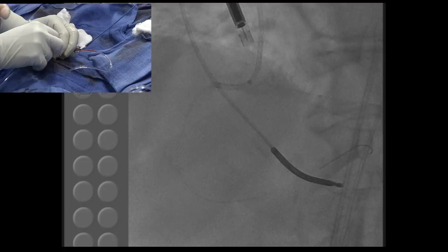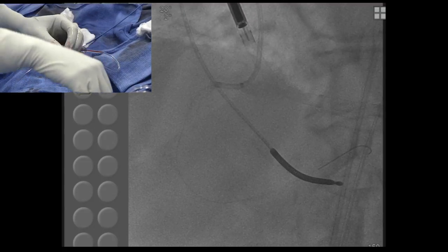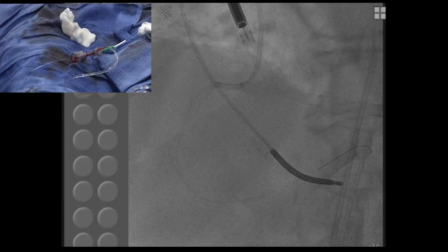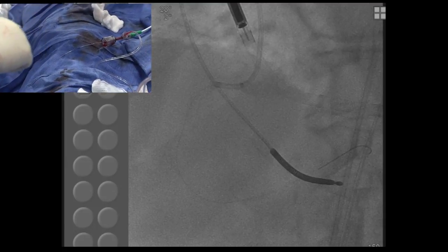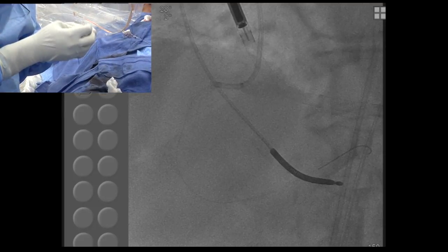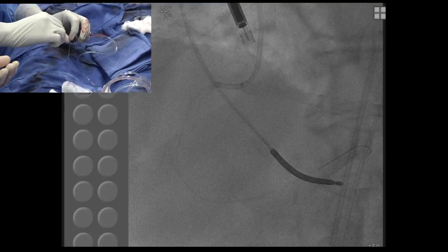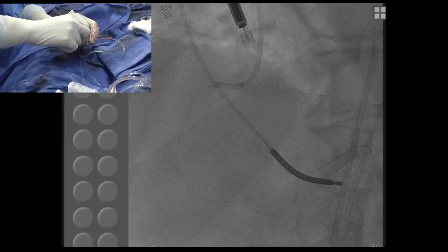Yeah, because the guide liner does not fit. The lumen of these guides, the Sherpa guides, is much smaller than our other guide. The lumen is 0.070 compared to 0.072. So even the guide liner has a very tight fit. We had removed the rota wire already, so now we just need to dilate that area and prepare the vascular bed. Now this is 3.0 30.